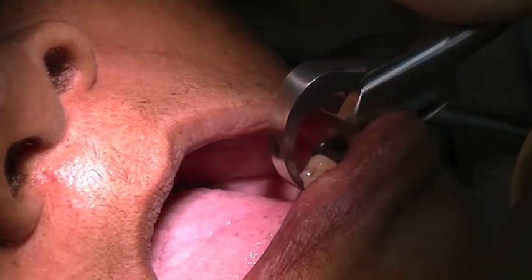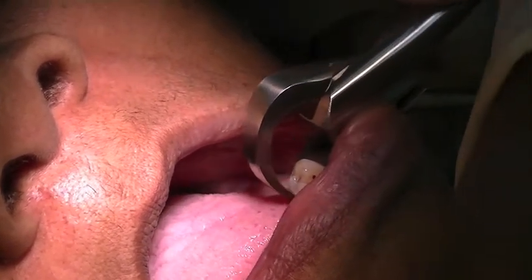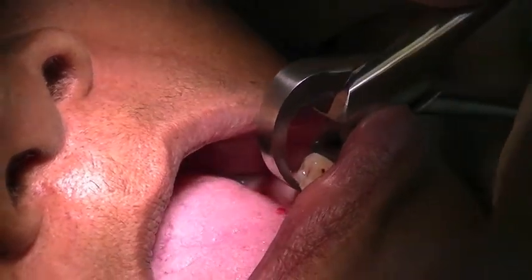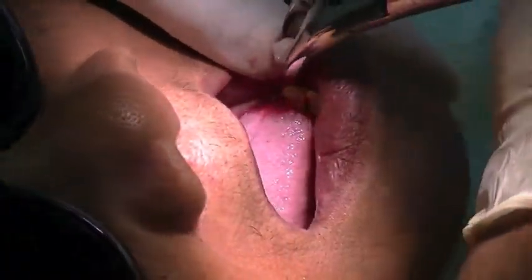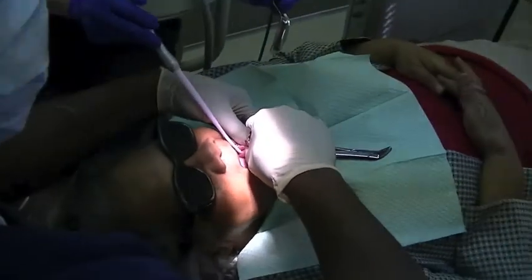Alright, so it's moved about 1 millimeter. I don't know if you can see. So now we're just going to pick up universal lower and finish extracting the tooth. Buccal bone still preserved.